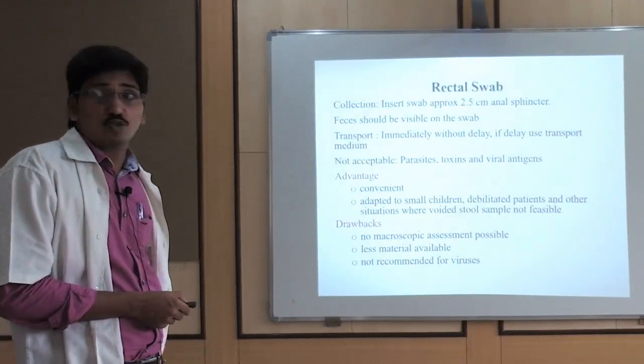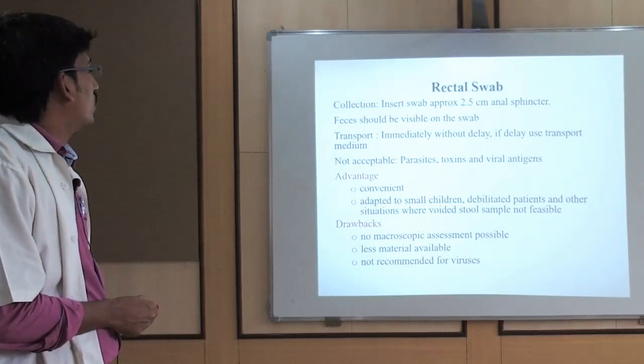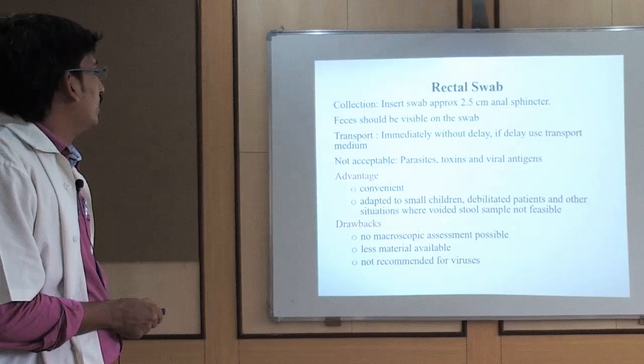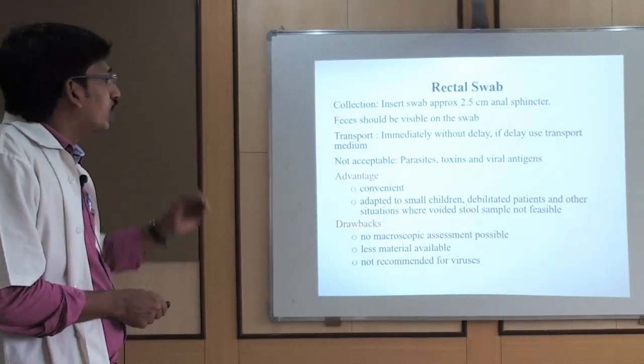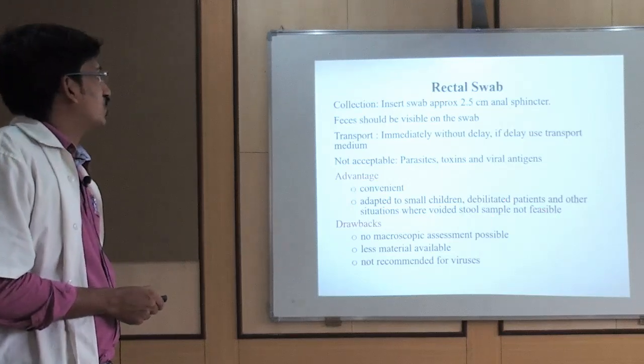And coming to rectal swab, this is mostly suitable for small children, debilitated patients, and other situations such as those who are unable to get out of the bed. In that situation you have to take this rectal swab.